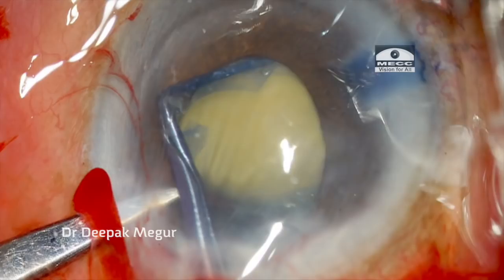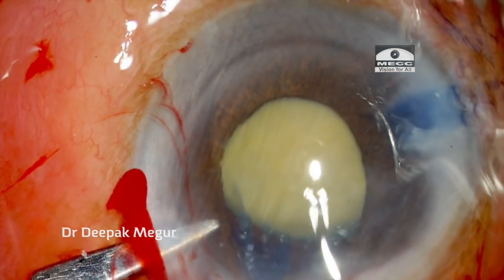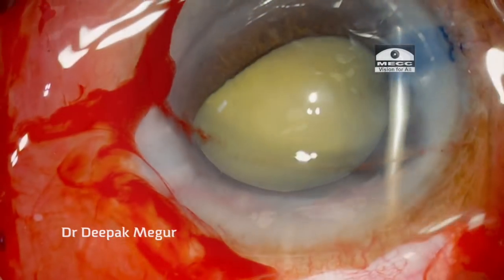Once the secondary rhexis is done, the nucleus can be managed very efficiently and again an intracapsular extraction can be avoided in these situations.